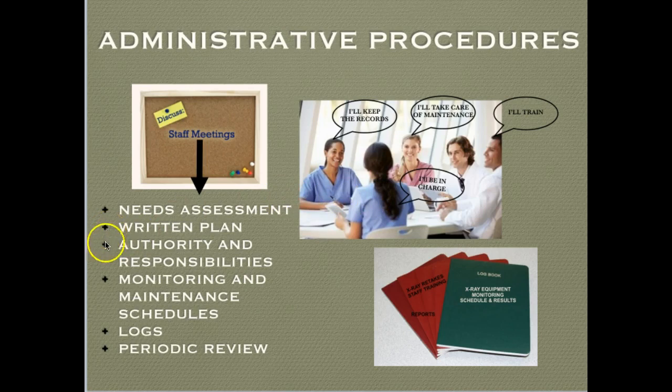So you have a written plan, and I've already talked about the various responsibilities and who would be willing to be in charge. It's important that you monitor and maintain and actually have a schedule written down, which would be a log, and we have a little photograph over here, so that you're keeping track of what you're doing to have a high quality radiographic treatment for your patient, or diagnostic aids, I should say, for your patient.